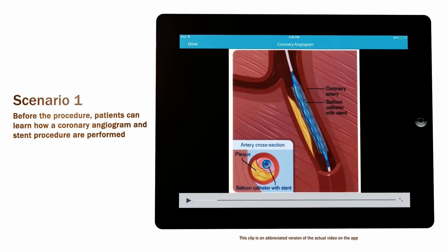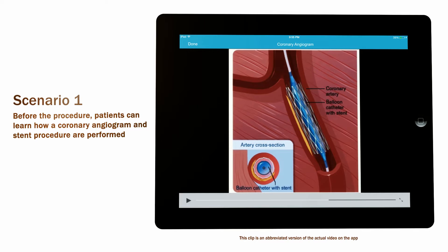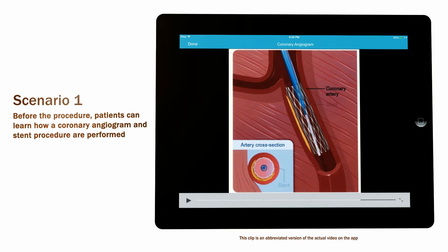Your doctor inflates the balloon, pushing the plaque against the artery wall and expanding the stent. The balloon is deflated and pulled out of the artery. The stent remains in the artery.